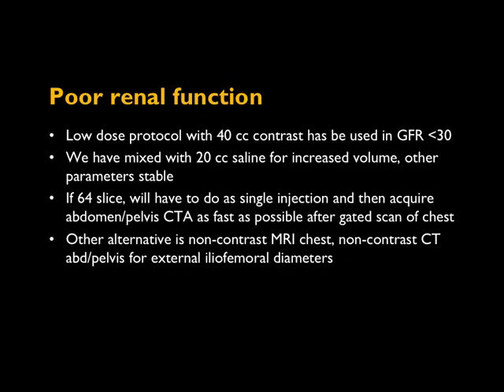Okay, one last note before we take a quick break. Patients with poor renal function, this comes up a lot. So these are older patients with comorbidities, and so it's not uncommon to have people with reduced renal function. I would say that we're actually fairly liberal with giving contrast, and certainly anybody up to a creatinine of 2, we feel pretty comfortable using contrast. We really haven't had any issues.